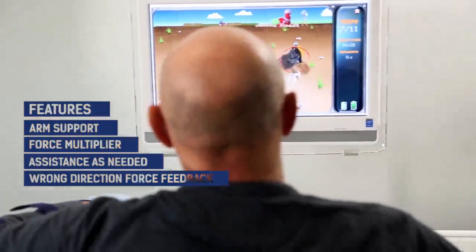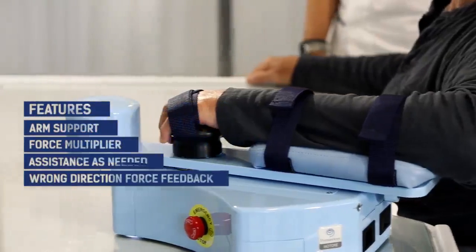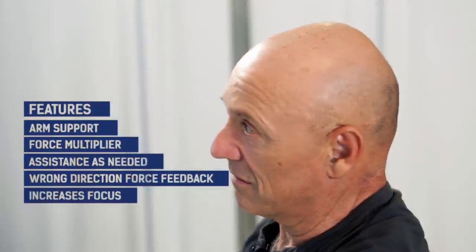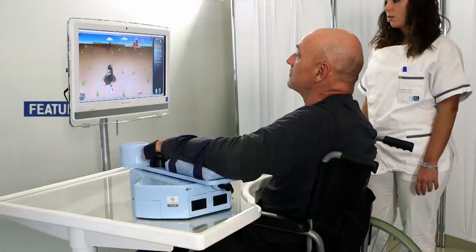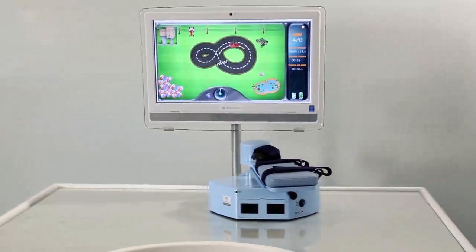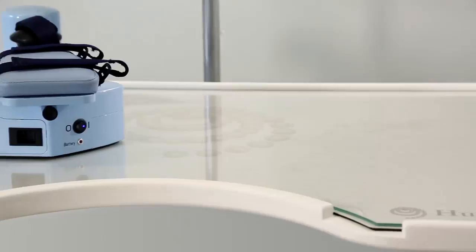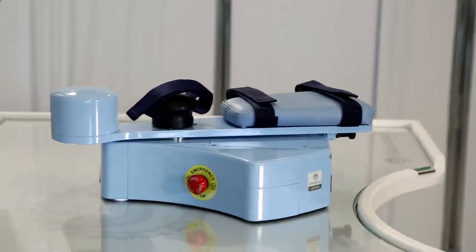The patient is supposed to be always aware and active, as is required in neurological rehabilitation. If the patient does not exert at least a small amount of force, Motore will not move. However, there is a software option which overrides this rule and makes the robot move even if the patient has severe hypotonia.